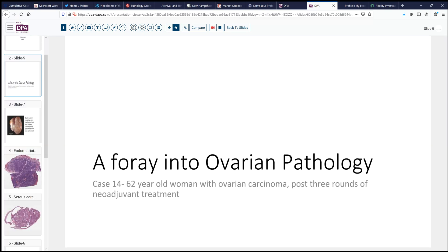We'll continue today and look further into ovarian pathology, looking at a very common scenario. This case is not particularly a diagnostic challenge, but does present some interesting points for discussion. The patient is a 62-year-old woman who had previously been noted to have ovarian carcinoma on a prior biopsy, and then underwent several months of treatment, following which a second-look or debulking procedure was carried out.